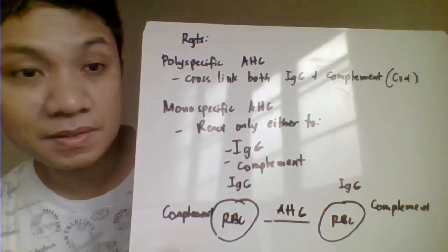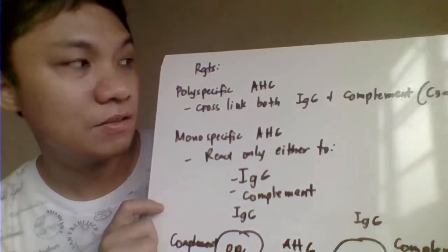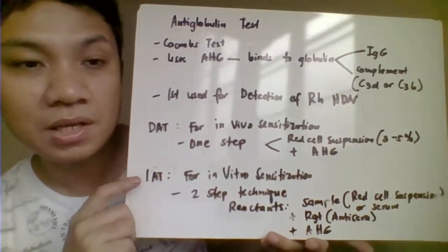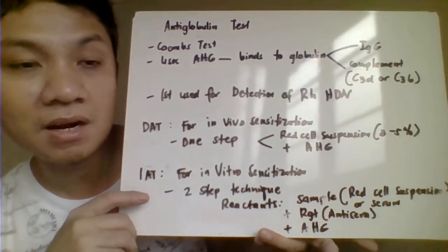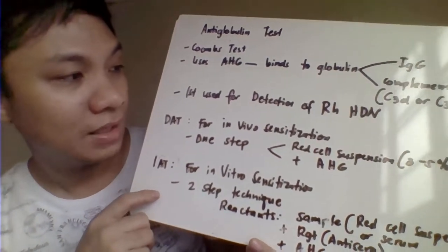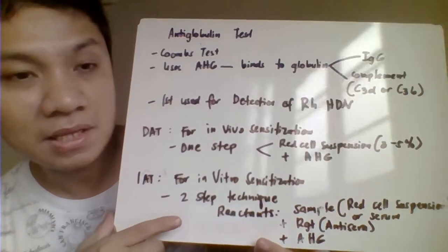And that's the entire principle of your Coombs test or your anti-human globulin. Again, you are using the anti-human globulin here to visualize your IgG coated or your complement coated results because, again, those are incomplete antibodies. They are small antibodies, so they cannot be visualized on their own.